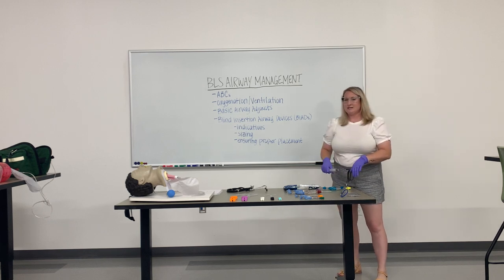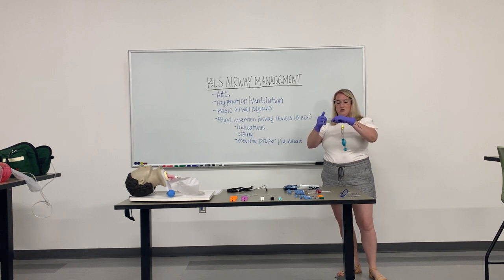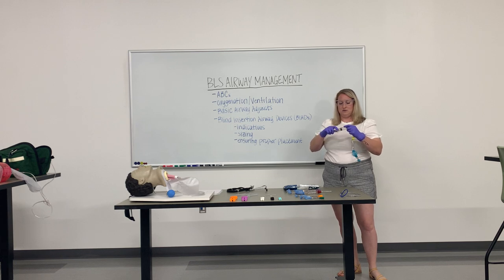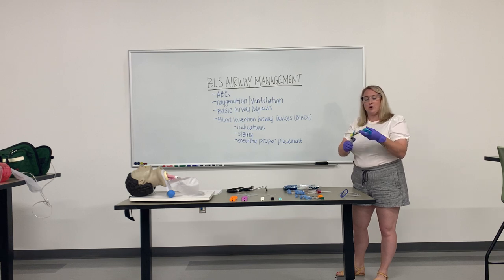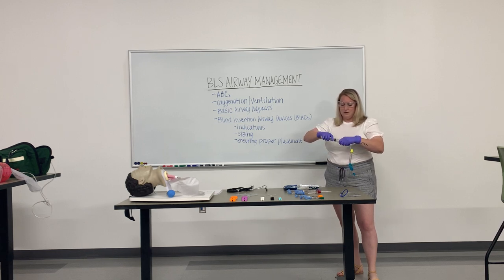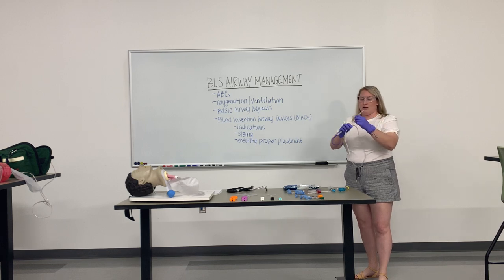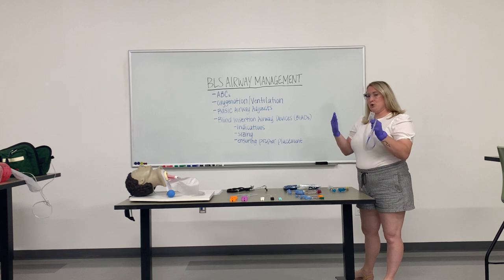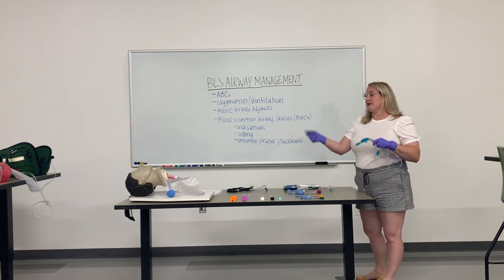What you want to do is test the equipment prior to inserting the airway. There are cuffs on the tube which secure the airway inside the individual — they generally hold about 60 cc's of air. Inflate them now to test and make sure there are no leaks inside of the airway adjunct. We want to lubricate the OG tube prior to insertion into the king tube, and we want to lubricate the king tube prior to inserting it into the individual.